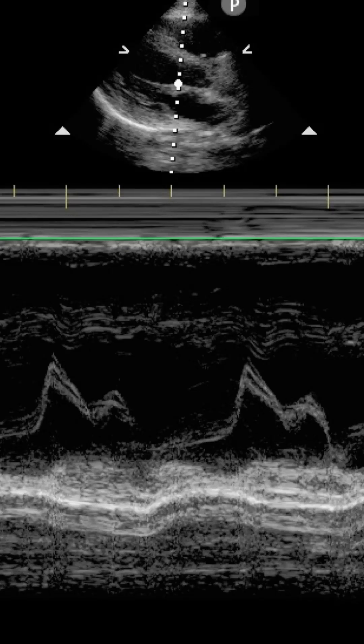Welcome back. In this clip we are looking at an M-mode tracing using the parasternal long axis window of the heart through the mitral valve leaflet tip. We're setting ourselves up for an E-point septal separation, or EPSS, measurement of this heart. EPSS is essentially a way of estimating ejection fraction based on the excursion of the mitral valve leaflet from the intraventricular septum.